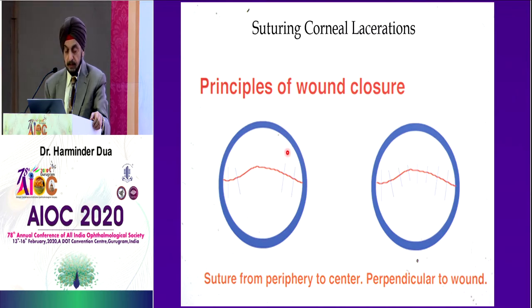So again here, as you can see, applied perpendicular, they don't have to be parallel to each other. It is just applied perpendicular to the point of application. Work your way from the attached part of the wound towards the center. So always suture from the extremities towards the center, not from the middle of the wound, which you think you're going to suture in the middle and then outwards.